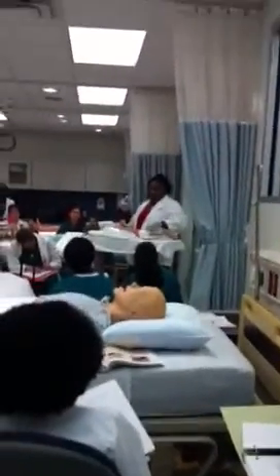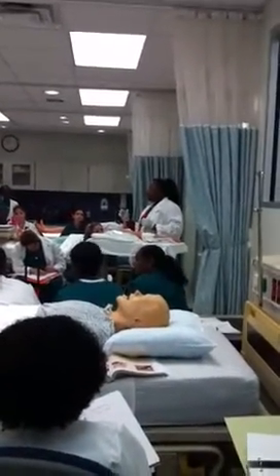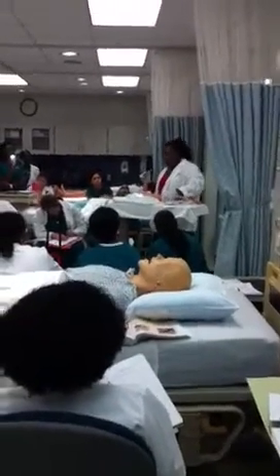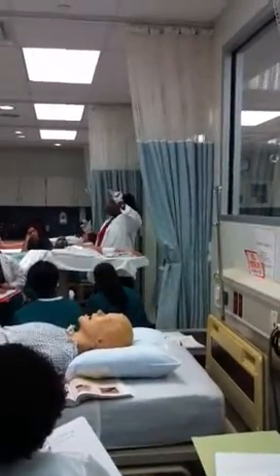Everything I need is right in there. Another nurse checking. I'm ready to give it. We'll check again. Humulin N, 10 units, 10 units. Where's my alcohol swab? Notice I brought two alcohol swabs.